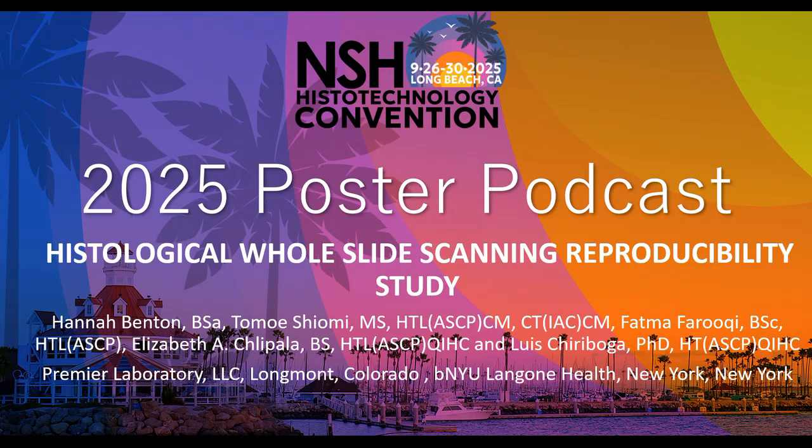And what we learned from the poster is that the bounding box area, the actual area of the scan, can impact staining intensity and optical density, because one of the samples that you provided was scanned at a larger area, and we couldn't use that one because it changed all the optical density. I'm not quite understanding why that is, but it did, so we knew we had to make sure that the bounding box, the area that we were scanning, was consistent across both institutions in order to compare it properly.